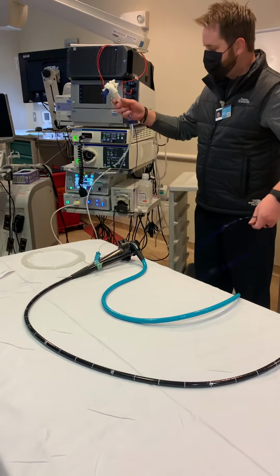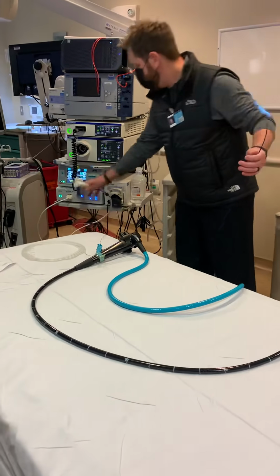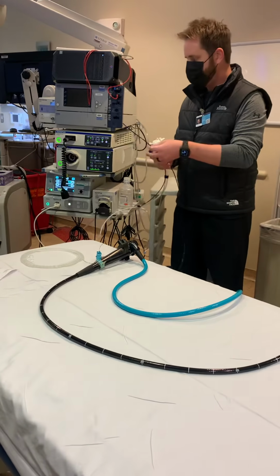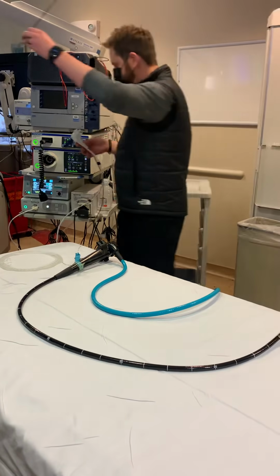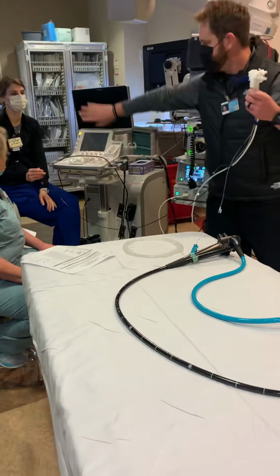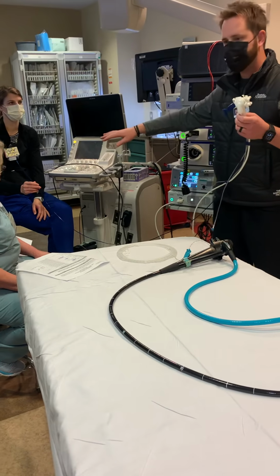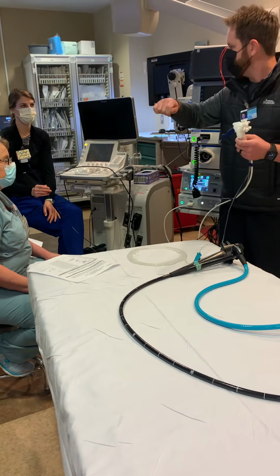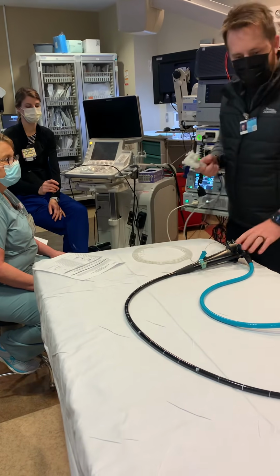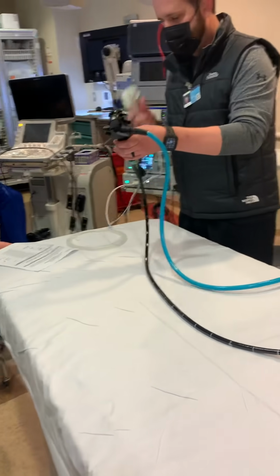So, after we remove it from the hula hoop, what you might do, just to save your eyes, is hit the light button, turn the light off for just a moment. And then luckily, you're going to have help in the room. So what you want to do is, you see how my catheter has no loops in it? You want to make sure that there's no loops in the catheter when you start to front load it over the guide wire that's already in the patient. So this patient, we've already beautifully cannulated. We're ready to use Spy.